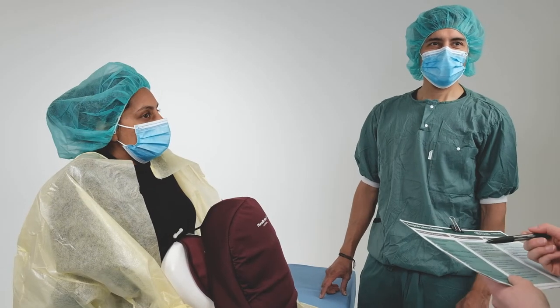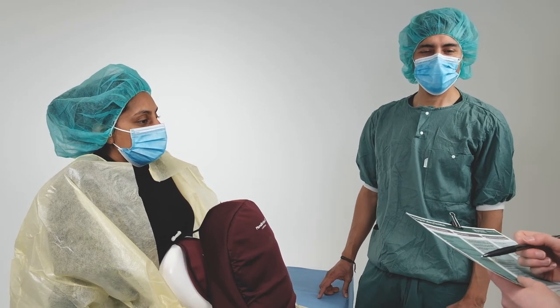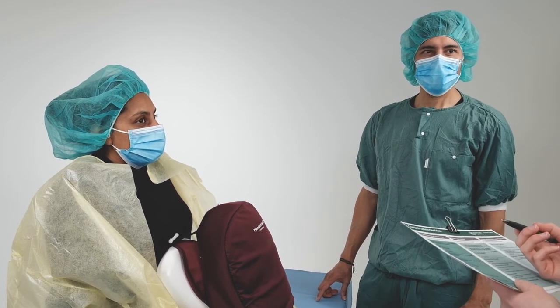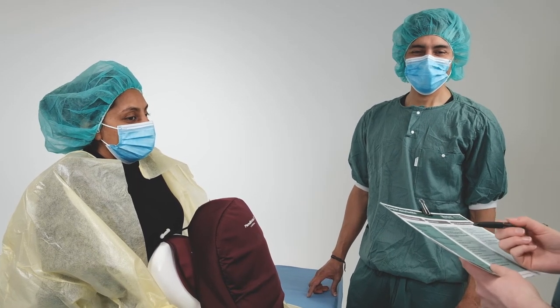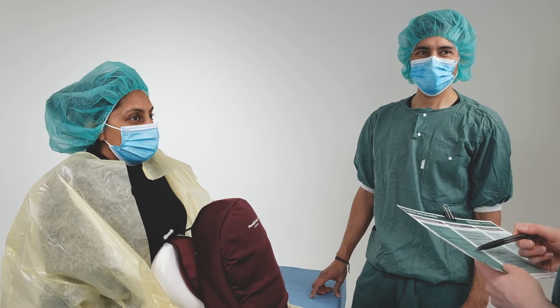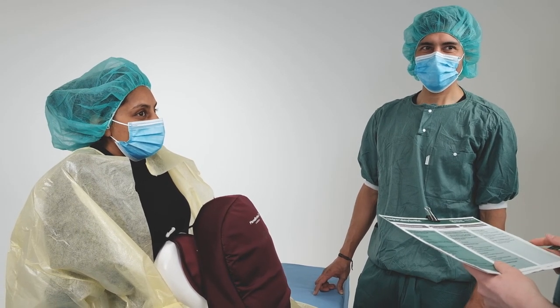One learner will take the role of a checklist coordinator. Communicate with the operating team to confirm all preparations are complete and anesthesia has been established. Use the sign-in section of the WHO surgical safety checklist or local protocols to help you.